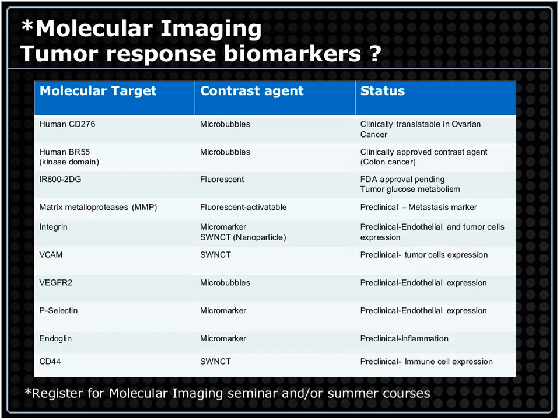All right. Since I just brought up the molecular imaging component of it, there are molecular markers or biomarkers that can influence a tumor response or can be used as an assay for tumor response. I have just listed them here. I strongly encourage registering for the molecular imaging seminar, as we will go into details in that particular seminar. But just for you to understand what's upcoming, what's happening with molecular markers, these have used micro-ultrasound or photoacoustics, depending on what contrast agents they have used in either one of the imaging modalities. I'd like to bring to your attention that the microbubbles targeted to BR55, which is the kinase domain, the human form of it, is now a clinically approved contrast agent, and it's been used. It was reported in a colon cancer study.